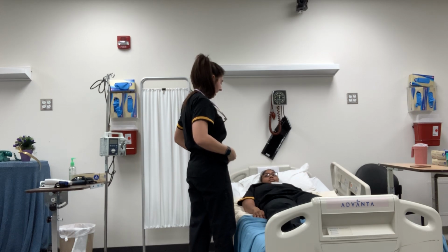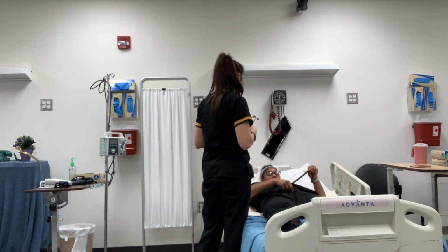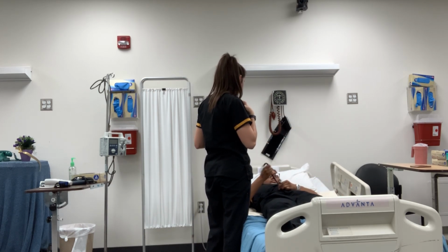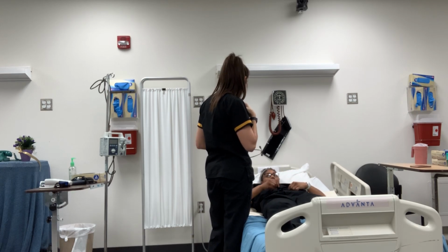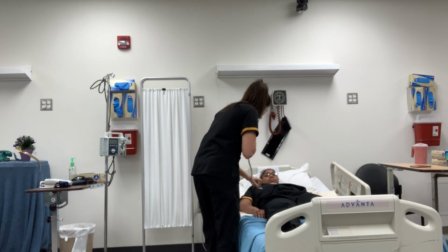Okay. So your apical pulse was about 86 beats a minute, so it's good. I'm gonna go ahead and have you lift your shirt up for me, and I'm gonna start off an abdominal assessment by inspecting, and there doesn't seem to be any discoloration or distension of the abdomen. Have you had any problems with your digestive system lately? No. Okay. Well, I'm gonna go ahead and listen to your right lower quadrant.